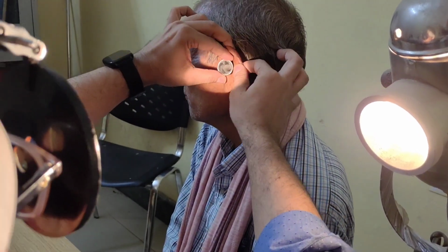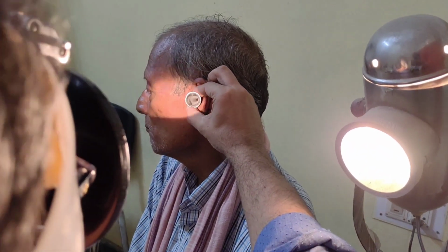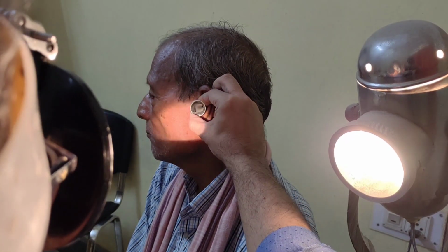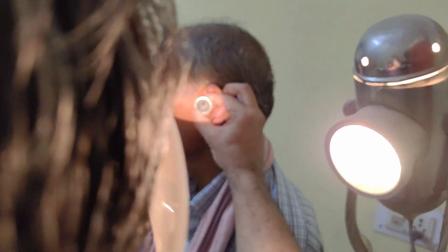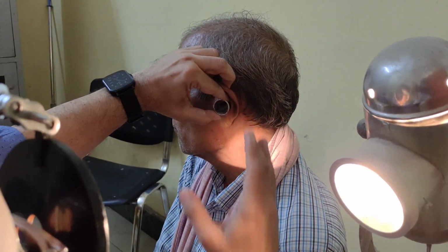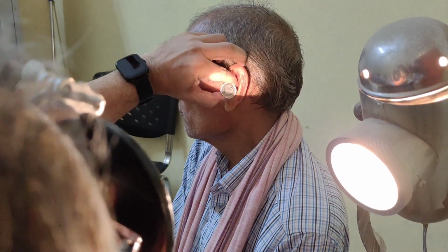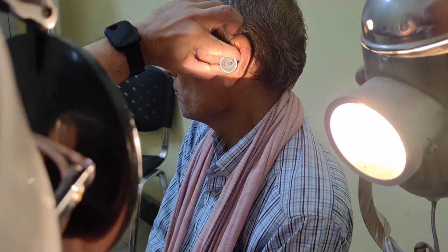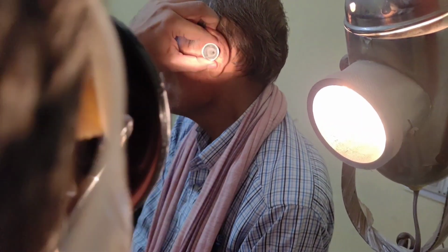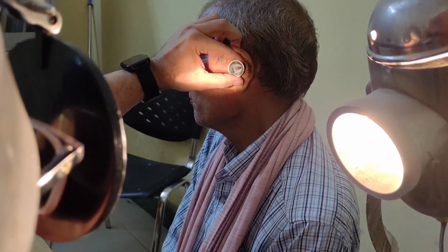so that you get a clear image inside. So that is how you hold the pinna as well as the speculum with one hand, so that you get a full focus on this, or you can hold it in this manner also. If you feel that the light is getting obstructed, you can hold it like this. With one hand I am pushing it outwards and backwards, and with the other hand I am holding it between the thumb and index finger. So I get a pure clean image inside, and I can visualize the tympanic membrane.